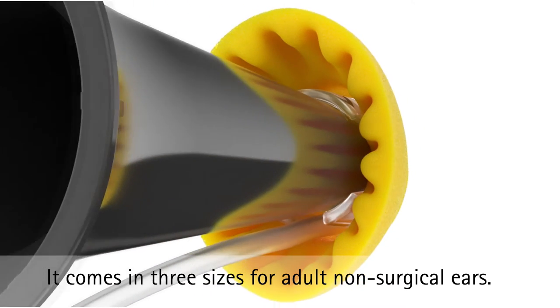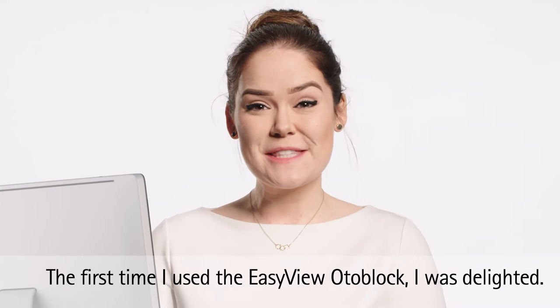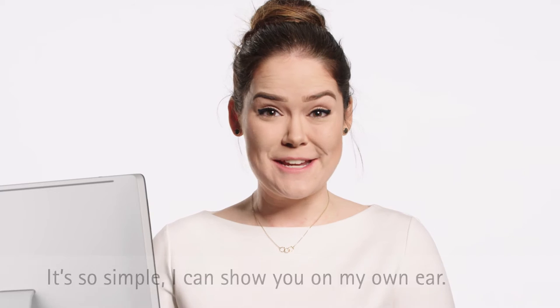It comes in three sizes for adult non-surgical ears. The first time I used the EasyView Otoblock, I was delighted. It's so simple, I can show you on my own ear.